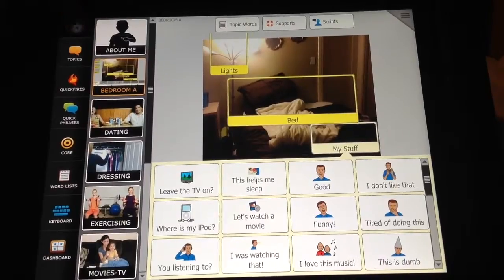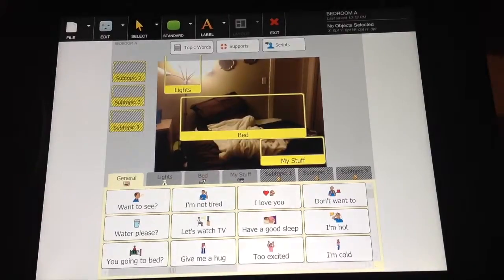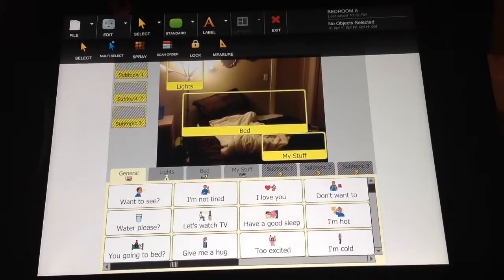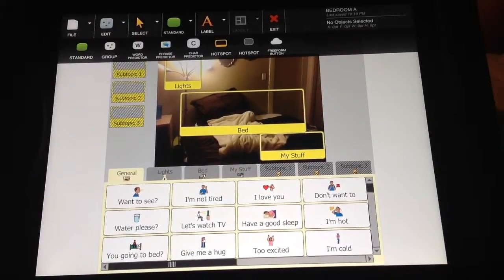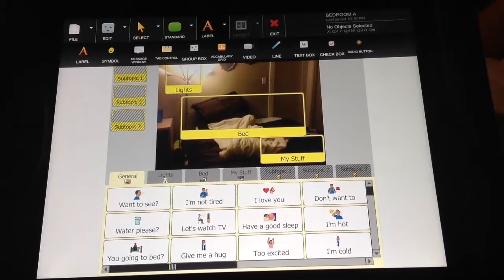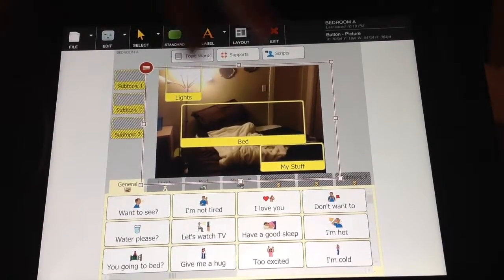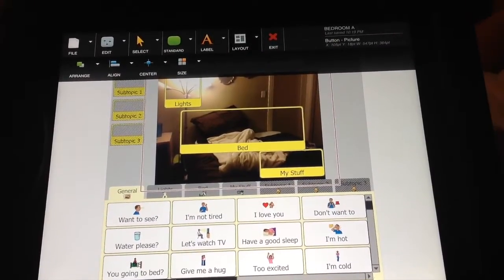You can also make adjustments by navigating to the Settings menu. Then go to Editor and do the same thing to the board, and then you'll see an editing bar which provides you more options. You can see all the different types of buttons that I have made with a huge range of options. I have a lights button, and by selecting it, you can also save it in different locations of the device. Select Exit to save your progress.